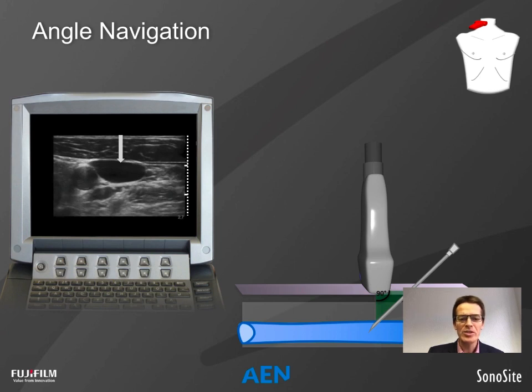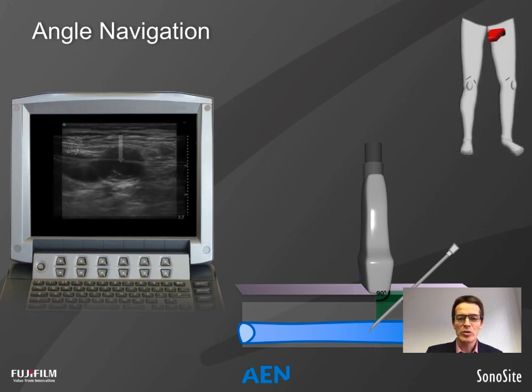So this is a method which is suitable for superficial structures like in vascular access, where you want to actually penetrate the target structure anyway, but we wouldn't recommend it to use in nerve blocks. So we show you an example.